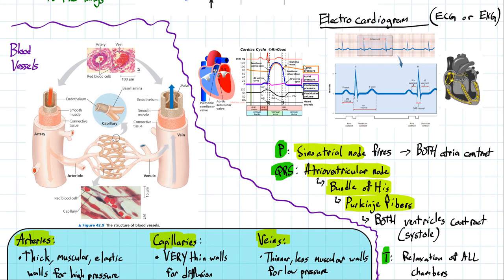The differences that we can notice here are labeled. We have this section here, which we call the P wave, this first little bump. This is one, this is one, this is one. These repeat over and over. We call it P, Q, R, S, and T.